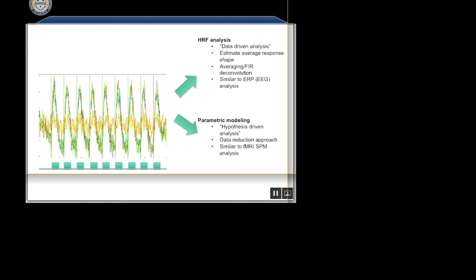By eye you can clearly see it's these couple channels, and those channels down there didn't change at all. If I map these on the head, and this was a finger tapping, the expectation would be these channels were over the motor cortex and these other channels were not. But as I said, most data doesn't look nearly this clean, and that's what I'm going to spend the rest of the talk talking about.